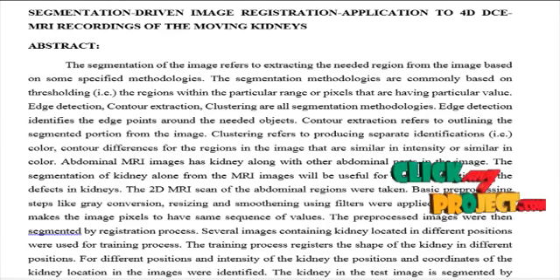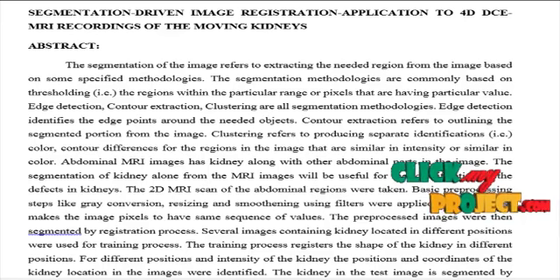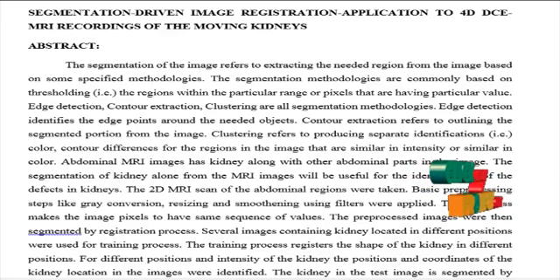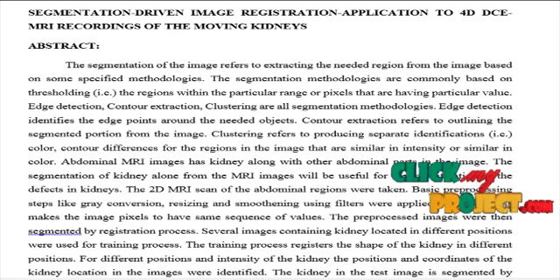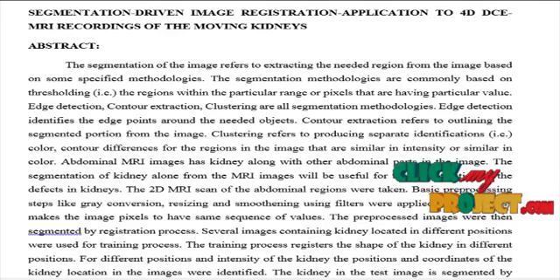The disease in the kidney images was identified based on the features extracted from the images based on statistical parameters. The extracted parameters for the process were classified based on the adaptive neuro-fuzzy inference system. The performance of the process is measured in terms of accuracy, sensitivity and specificity of the process.